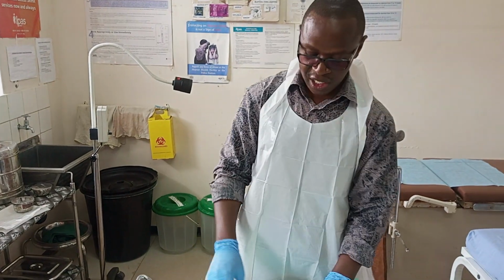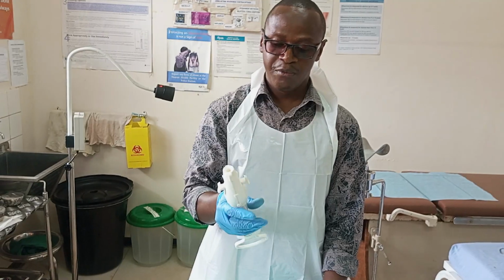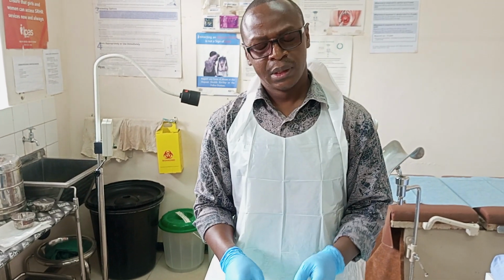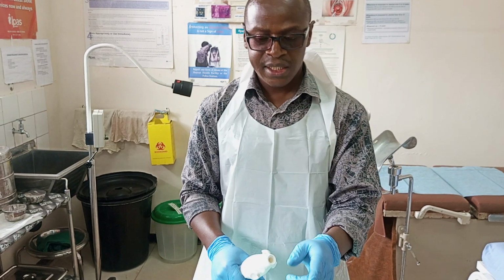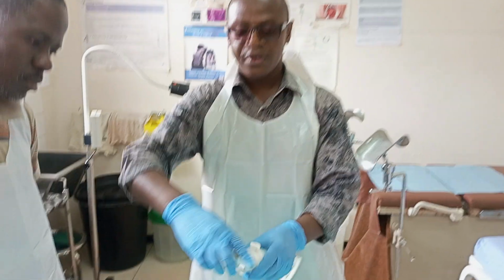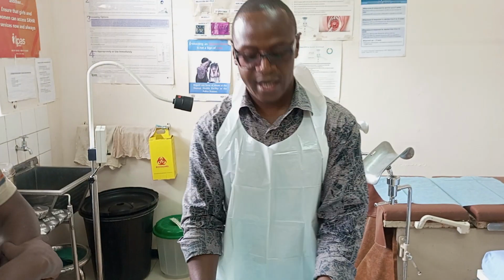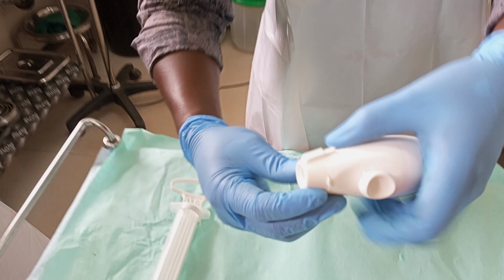Welcome once again. This time around, we are going to demonstrate how to dismantle the MVA aspirator. First things first, there is no specific documented stage or approach that you should start with. You can either start dismantling from the other end or first separate this aspirator from the cylinder and the flange. Okay, you can come here and remove the cap.